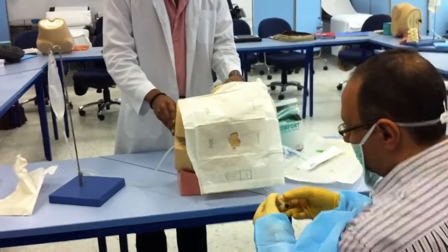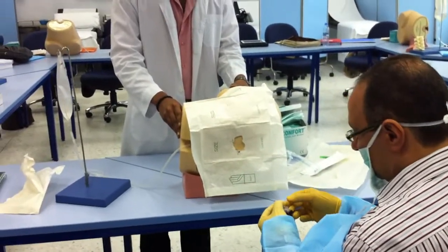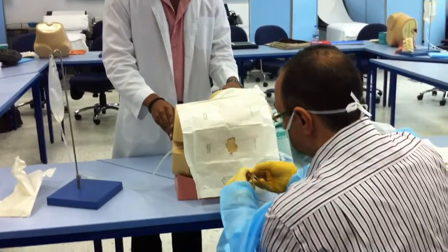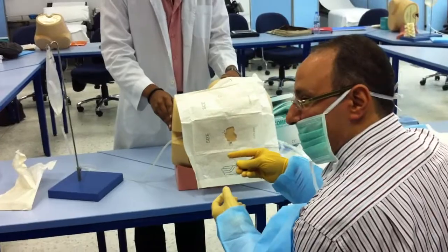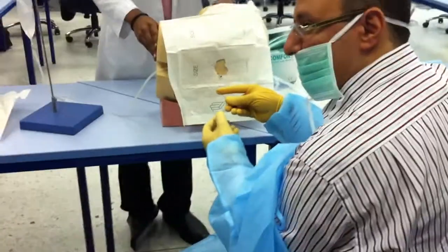There are two techniques for holding the needle. Some people hold it in the closed position, and some people hold it like a pencil to support the needle and provide a stable grip.